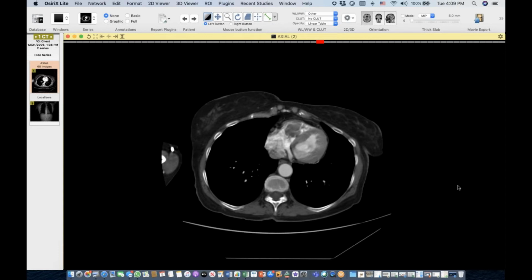I think that really relates to pathology literature and autopsy rather than what we see in imaging. I think that's true. I also think maybe the game is changing a bit as the scanners have gotten better, and we can see the cardiac chambers and detail in them on routine scans better, so we're picking up more intracardiac metastases than we used to pick up. Correct. That may be very true as well.